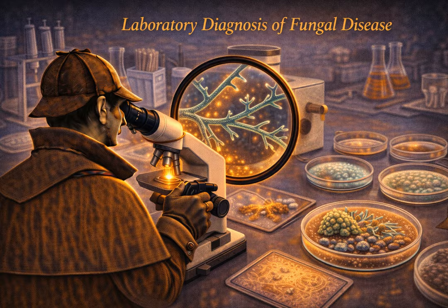It's getting better for molds, but molds are inherently trickier. Their phenotypes vary more depending on how long they've grown, and their complex chitin cell walls are much harder to break open to get the internal proteins out for the laser. But for common molds like Aspergillus, it's rapidly becoming the standard of care. So MALDI-TOF is the speed demon of culture ID. But, and this is a big but, even MALDI-TOF requires a colony to grow on a plate first. And as we said, fungal growth can be very slow.